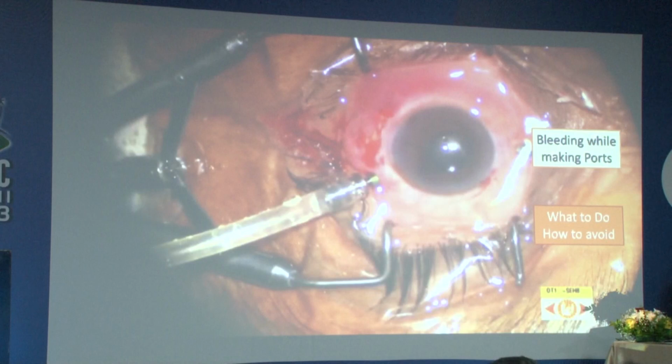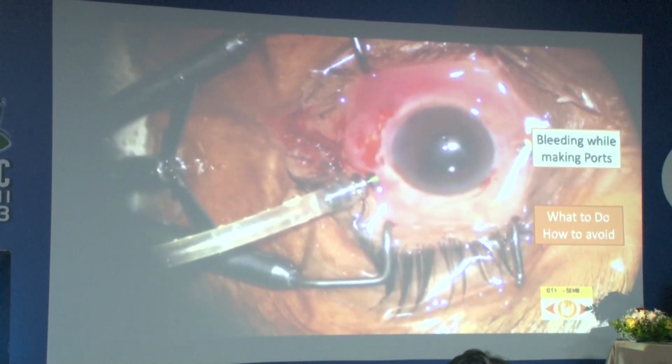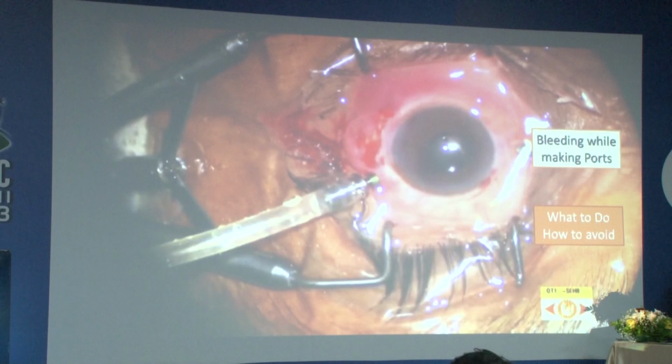Obviously, from the sclerotomy side there may already be some proliferation or anterior hyaloid, that can be one reason, and these are difficult to anticipate. If there is vitreous hemorrhage, you can't see the fundus, and as the situation evolves, we'll have to handle that. In resurgeries we are aware of this situation.